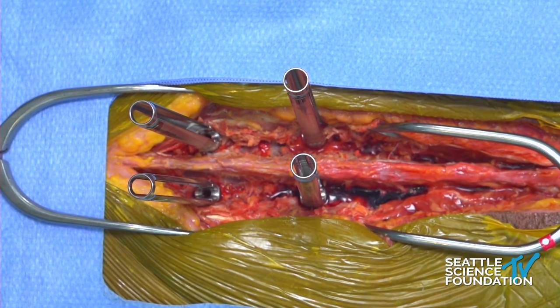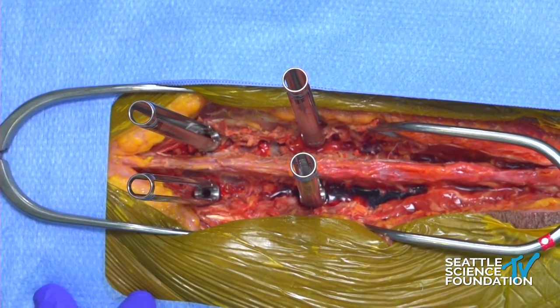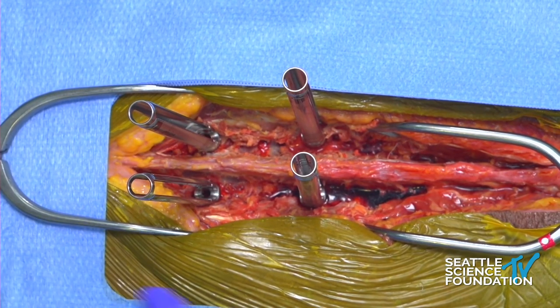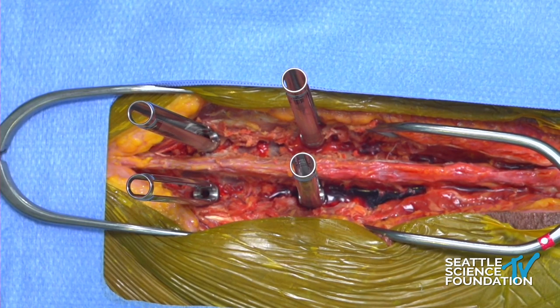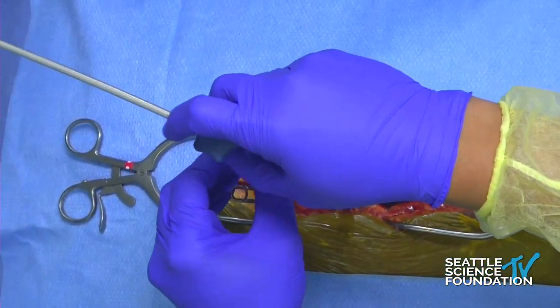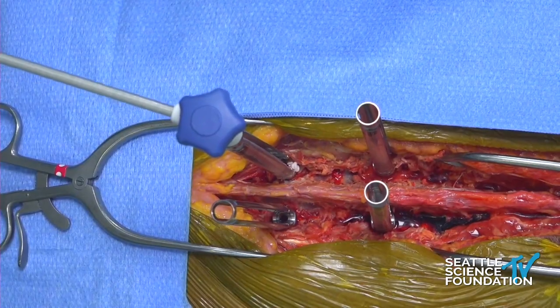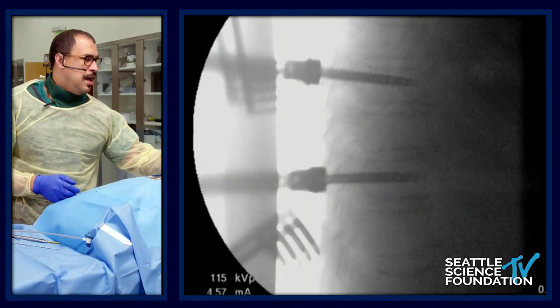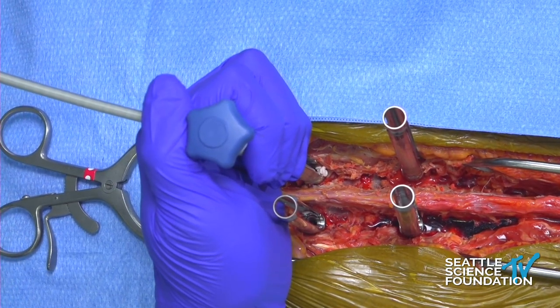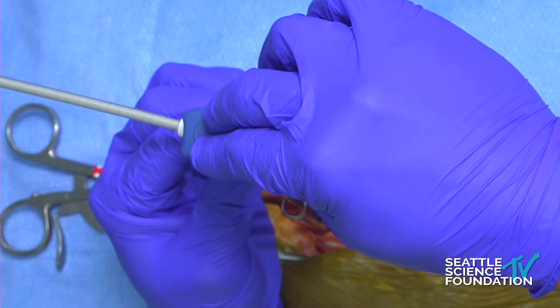Let us know when you're ready with the cement and we will get started. One of the things that I like to do is use these at the very top and bottom of the construct. If we need several applicators, we'll have one of our fellows working at the top of the construct and I'll be working at the bottom so that we have very clear visualization of what is happening at each level. Give us a shot on the lateral. How many twists per cc? We want to go for about 1.5 cc per screw — three full turns.